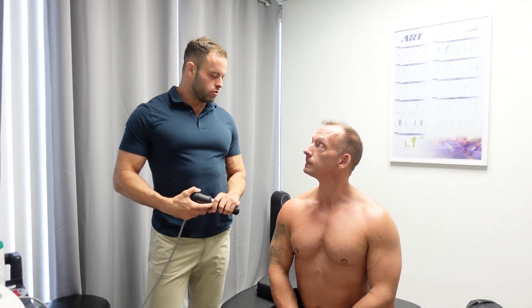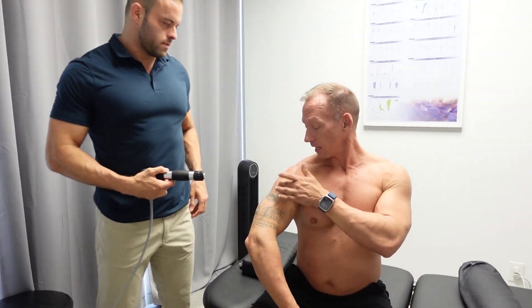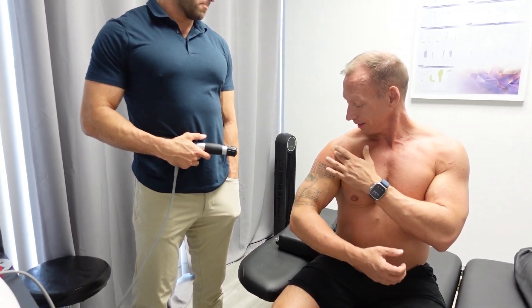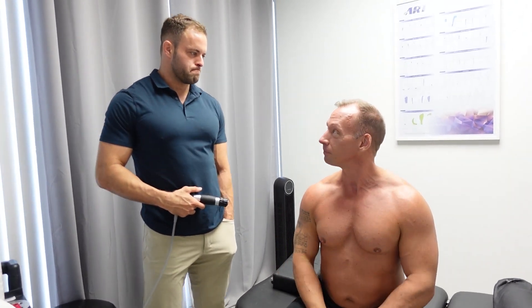Alright guys, so we just wrapped up treatment with Dr. Eric. Each treatment lasts about two minutes. What did you think? Man, it was great. I felt a lot in my lateral deltoid and then around probably the labrum, but it felt like a deep massage — like if somebody really worked on you, but not overly bad.